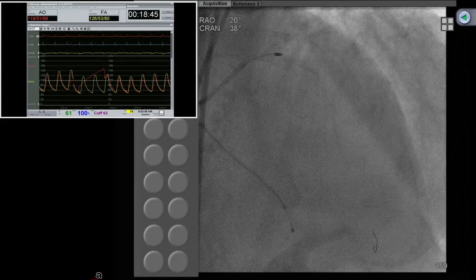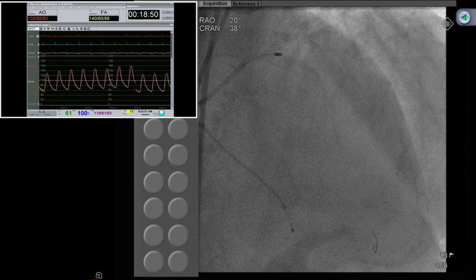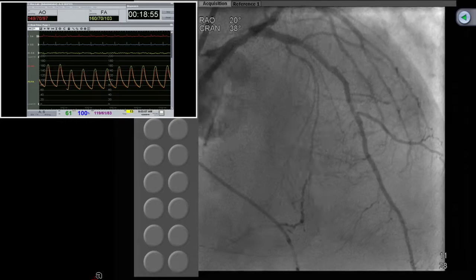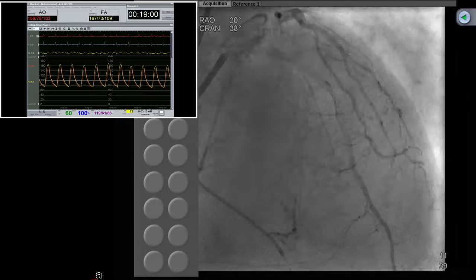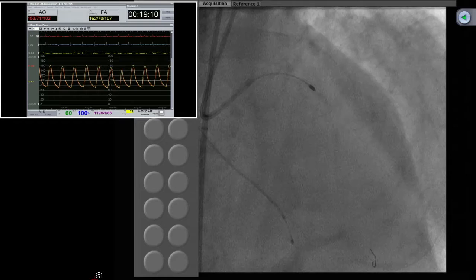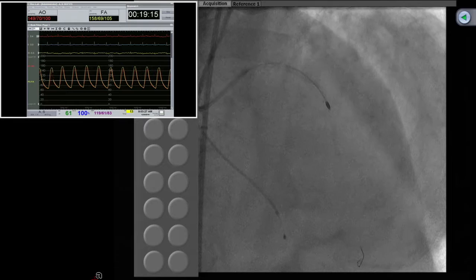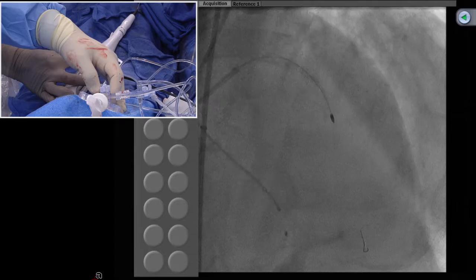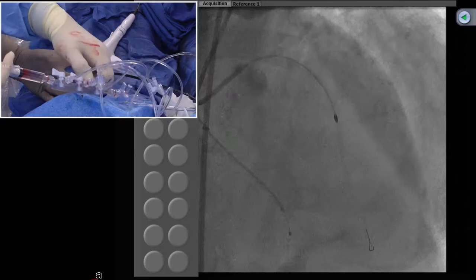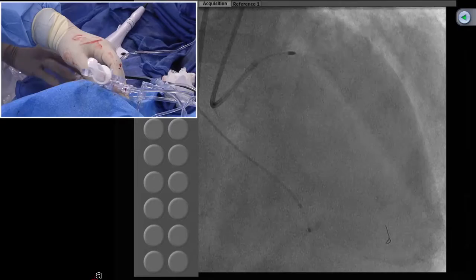We proceed 20 seconds at a time and come back all the way, placing the rotational burr where indicated — not in the left main, but in the proximal LAD, since the proximal LAD is essentially non-obstructive. When I start working, I've completed the mid LAD, and now I go all the way to the distal LAD. Speed is around 156,000 RPM. The pecking motion is done right at the tightest lesion.